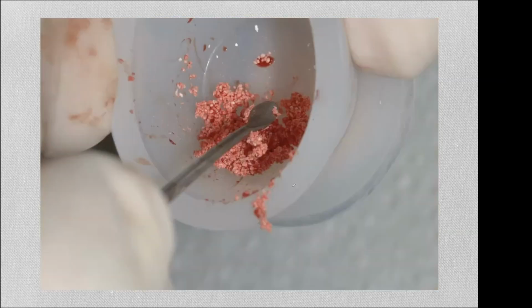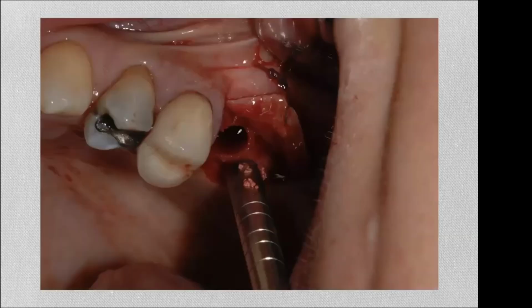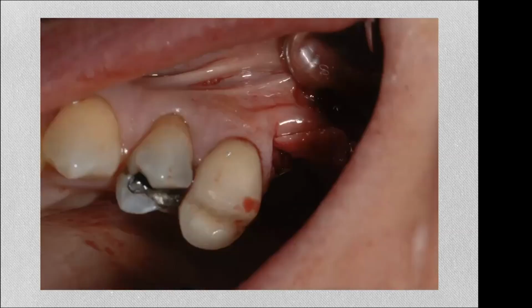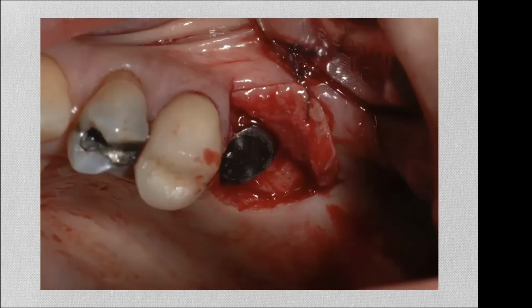The graft is lifted, is mixed again with bone. It's not a slurry stage because most of the lifting was done in this case, and there wasn't much to be dissected with that. We didn't need a very large graft. So I introduced it very slowly, packing and so on. Place the sinus lift abutment with the 5x6 ultra short implant and carried them as a unit into the osteotomy and seated it. Okay. Tap hard.